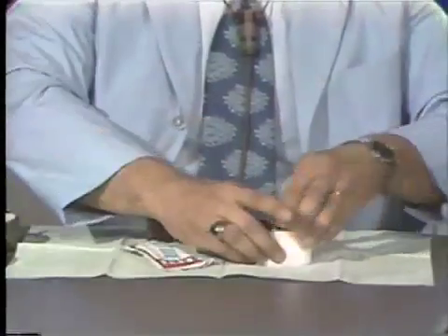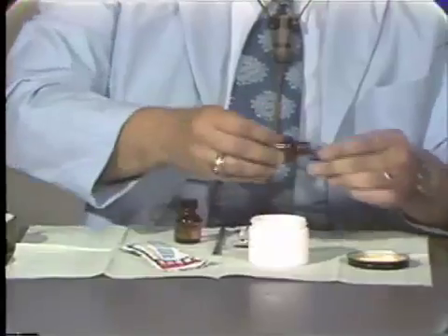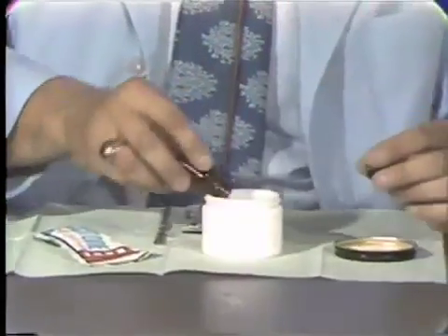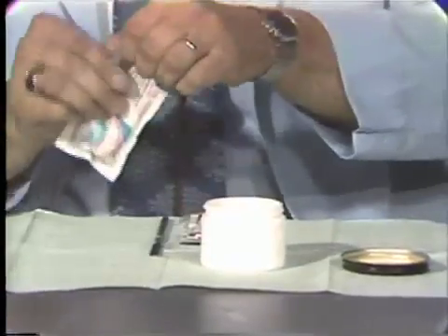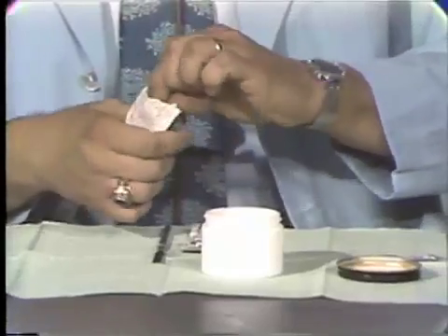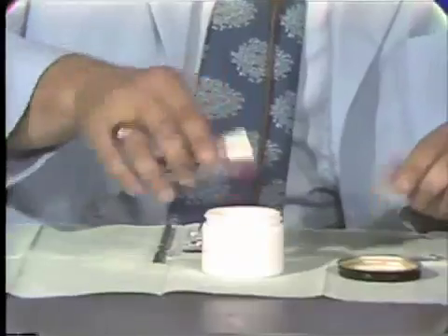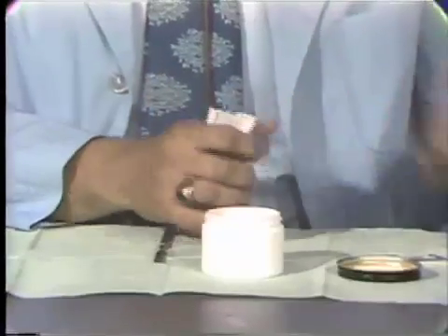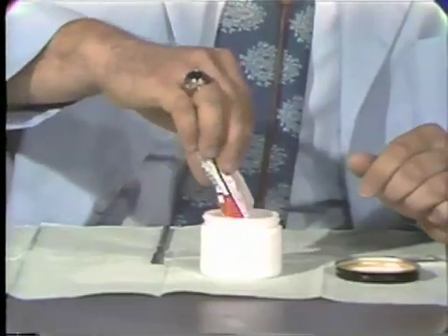To begin with, we will put the monomer in the mixing jar. I'm going to use two units because we will be processing a maxillary and mandibular denture. As you are all aware, we add the polymer to the monomer. When we do this, we try to avoid any excess mixing of the material so that we do not get air bubbles or pockets in the acrylic.